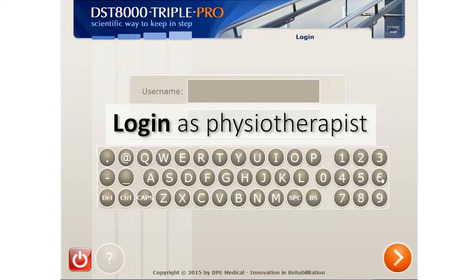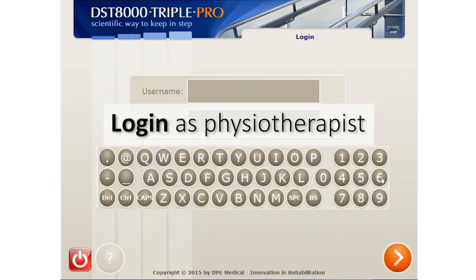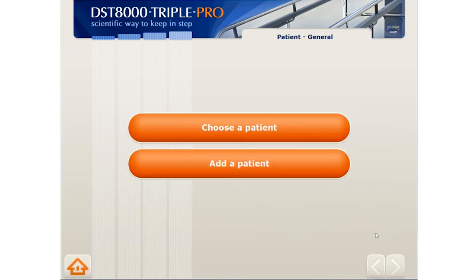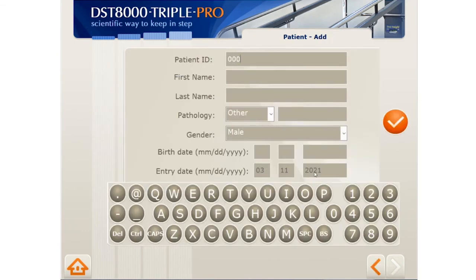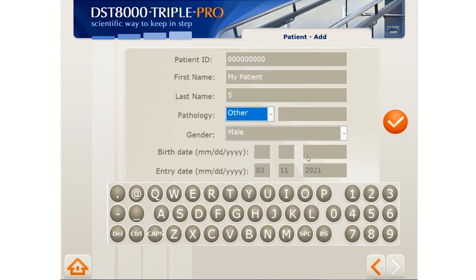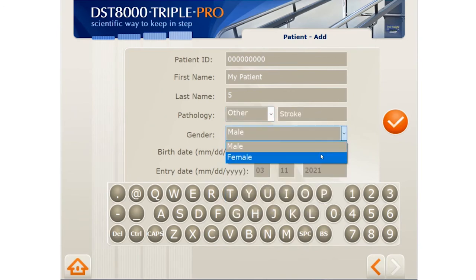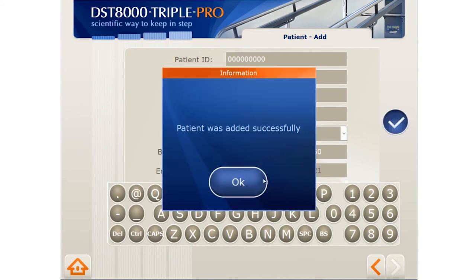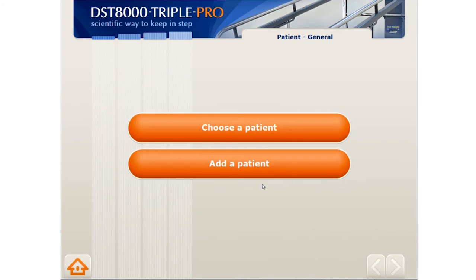Now let's log in as a PT to start working with patients. Use the username and password issued to you by the administrator. We should first add patients. You can choose a pathology from the list, or mark 'other' and write your own text. Now we can start practicing.